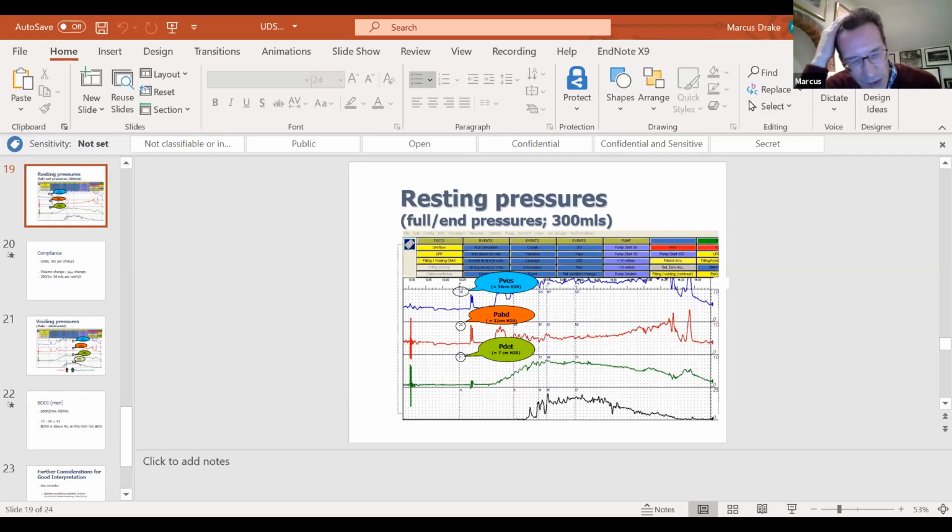It's quite rare for cystometric capacity to go above 500 mils. Of course, it can do. So I agree with you that if they are comfortable at 500 mils and look like they would accept further, then it would be worth doing another round of provocation tests at 500 mils. My honest answer is there's no standardized approach to that. You want to take a practical line by doing a set of provocation tests when the bladder's fairly full but certainly manageable, like 200 mils, so that you have banked some before the patient becomes desperate for a pee, making it much harder to do your filling cystometry provocations.